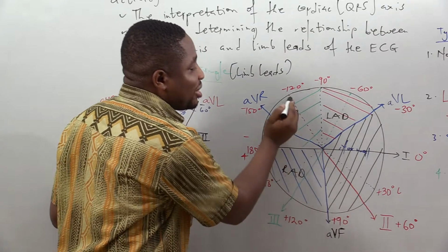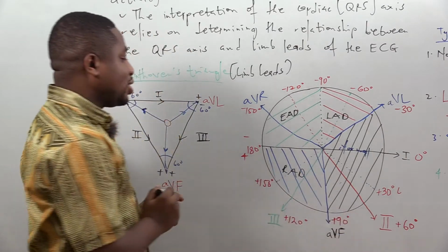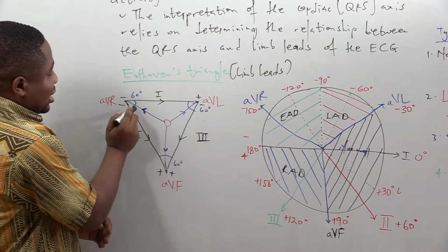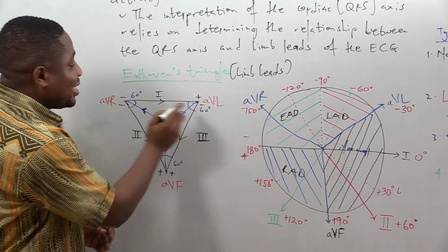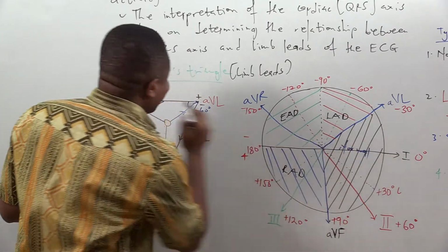Only this and the other we are using a dot. Okay, so this becomes our lead 2. And lead 2 will be at what angle? Look, lead 2 here, you can see that with respect to the horizontal line, is giving us 60 degrees. So in the same way, this is lead 1, and this is lead 2.